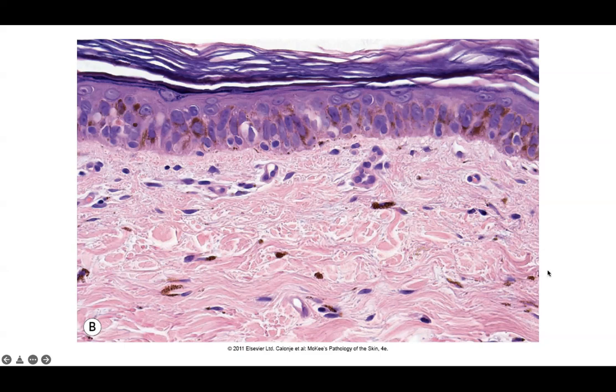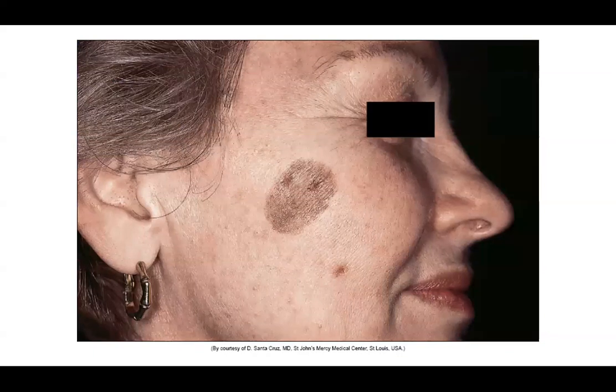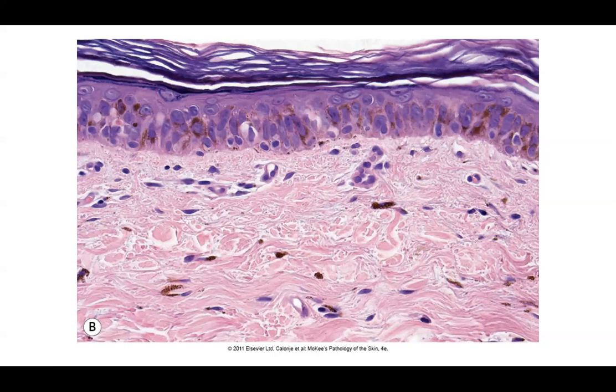The other thing that is important is to rule out melanoma. Clinically, this may come in as rule out macular seborrheic keratosis, rule out solar lentigo, rule out melanoma in situ. So being able to rule all of those things out, doing a SOX10 stain, making sure that these are not abnormal melanocytes and you're not dealing with a melanoma in situ, that's all going to be extremely important.